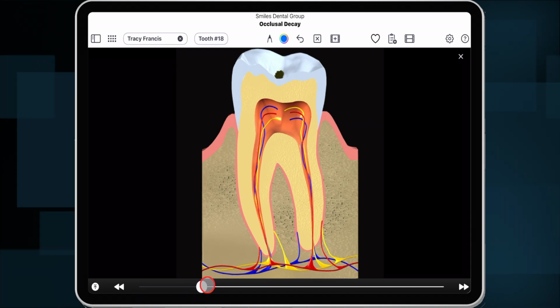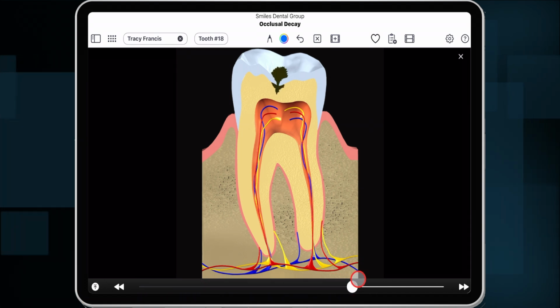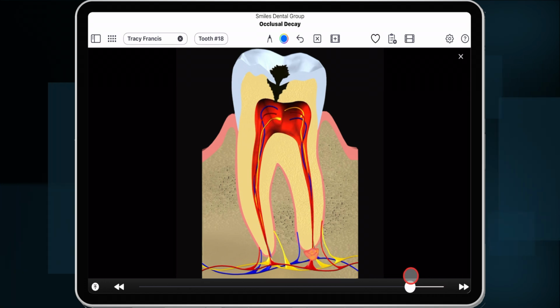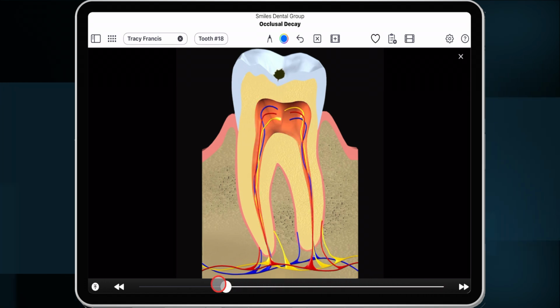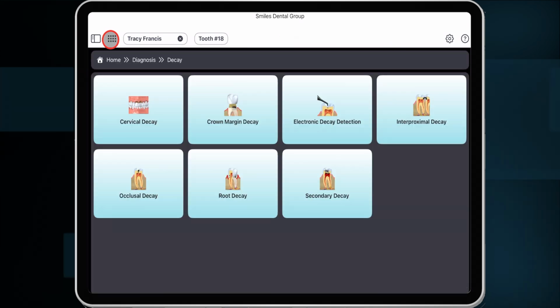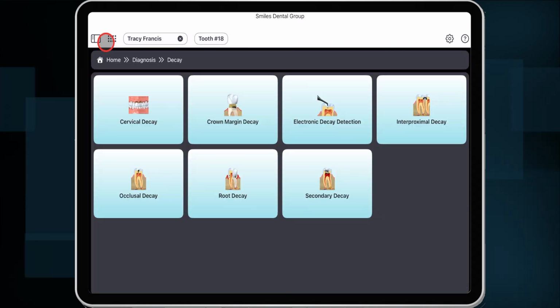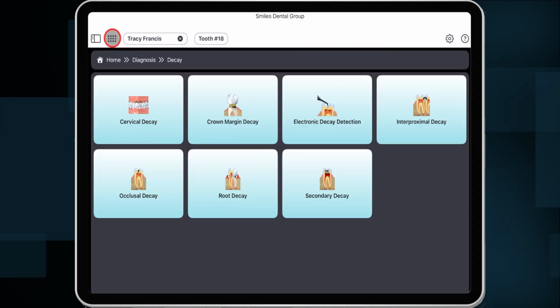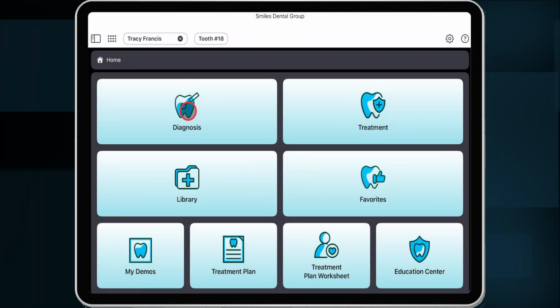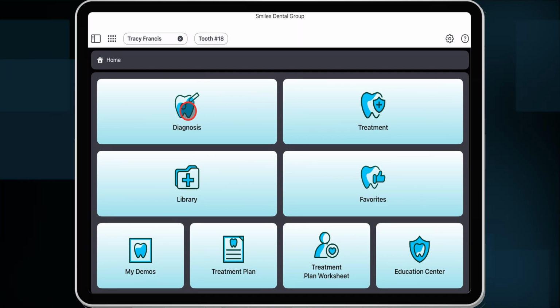Instead of just saying, you need a crown, you're showing the patient why the crown is needed. And when people understand the problem clearly and why it's so important to address it before it worsens, they're far more likely to accept the proposed solution. Too often, we skip the explanation and go straight to the fix. But defining the problem first, not just the treatment, shows respect for your patient's intelligence and puts them in a better place to say yes to care.